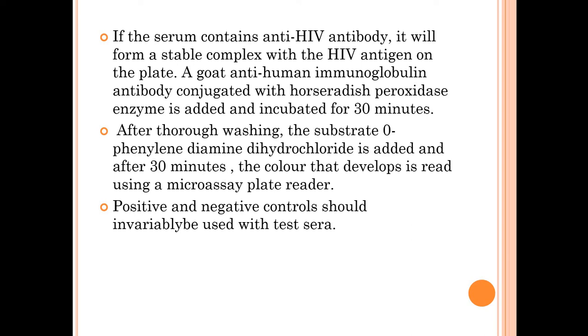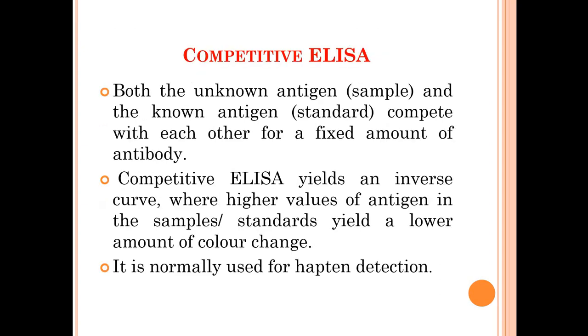Then again incubated for 30 minutes. And after thorough washing, the substrate orthophenylene diamine dihydrochloride is added. So remember for MCQ the name of the enzyme and its substrate. Here for the HIV testing, horseradish peroxidase enzyme is used, and the substrate is orthophenylene diamine dihydrochloride. Again it is allowed to react for 30 minutes. If there is development of color, it indicates that the test is positive. Okay. But along with every test, we always have to keep a positive and negative control.